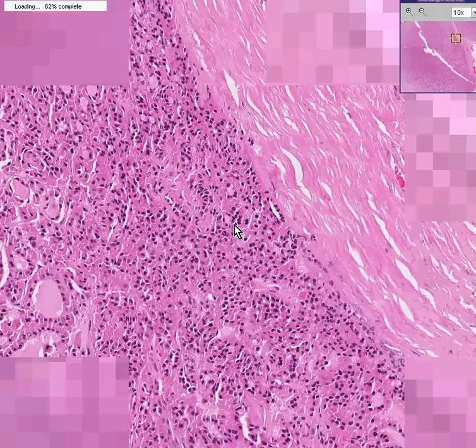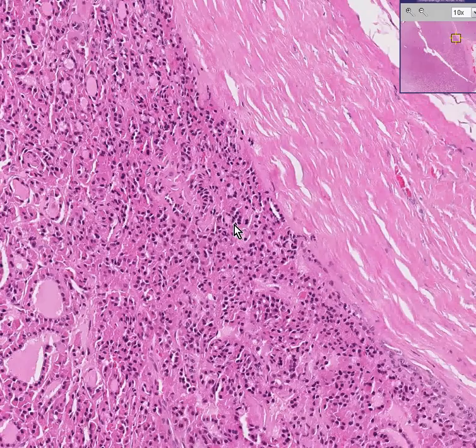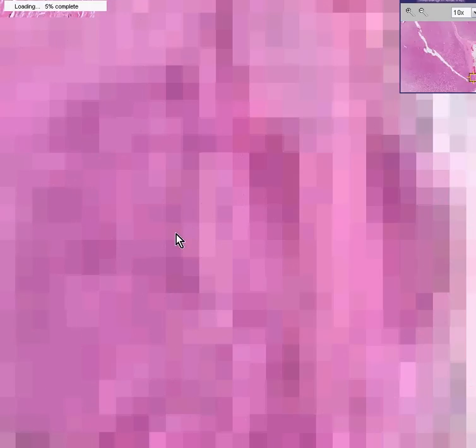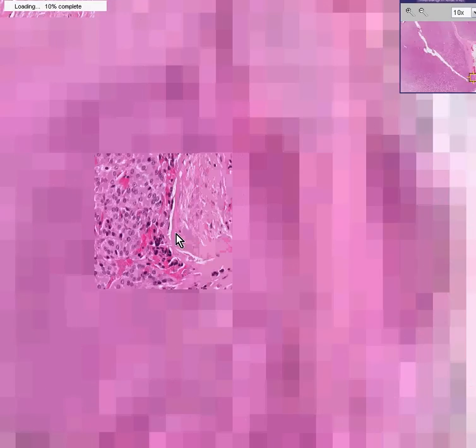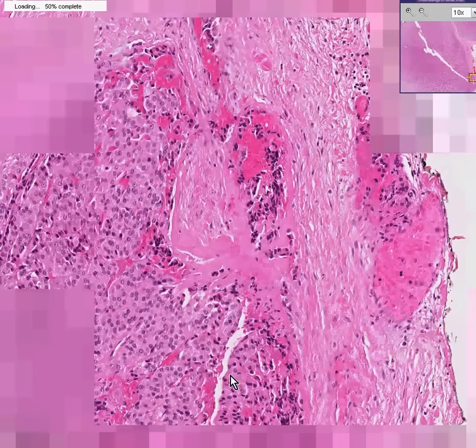Notice in this area, however, the tumor seems to be very nicely demarcated from the surrounding capsule. But remember, in this other area, we can see the tumor invading the capsule right here.